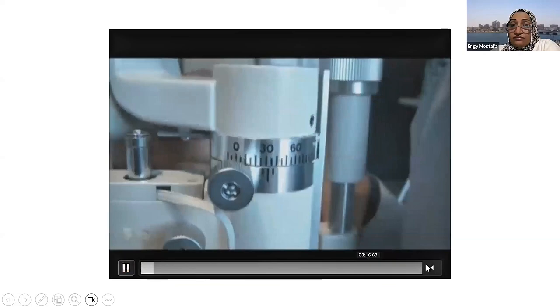The endothelial cells here, like in this photo, are highly magnified. Of course, we do not acquire such an image with our slit lamps, but we can get an idea during our examination whether this patient is suffering from endothelial defects or not. So this time it is 60 degrees between them, and we are going to change the place of the viewing system.